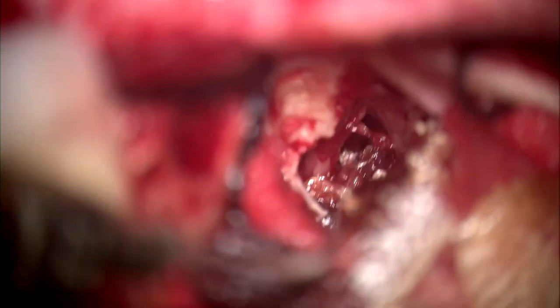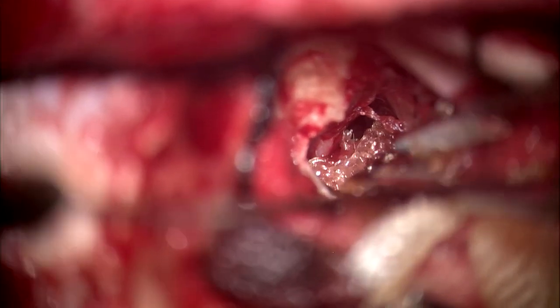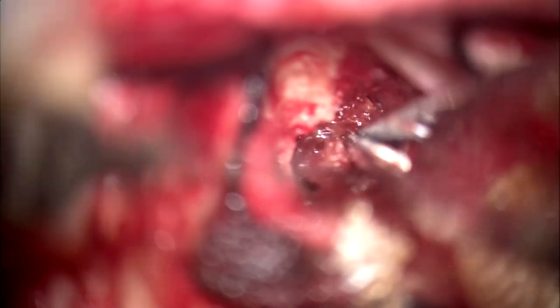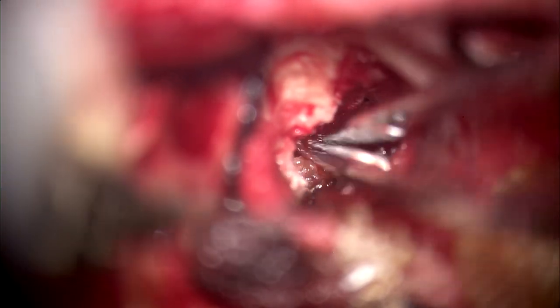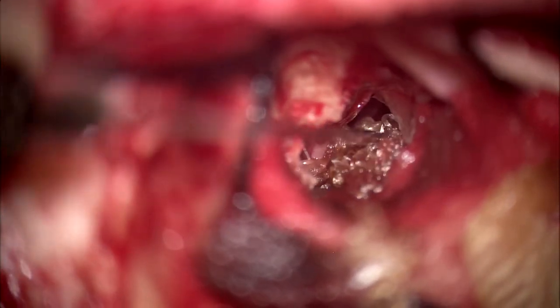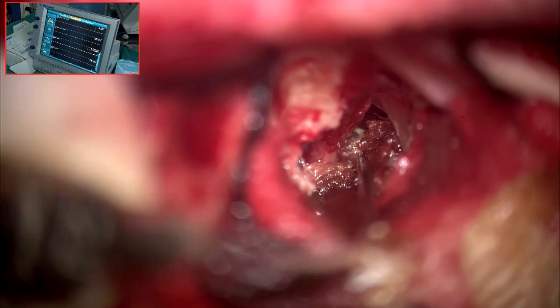See that the facial nerve now. Yes, sir. See in the middle of the field. Can you see or not this facial nerve now? Yes, we can see, sir. That's the facial nerve. Now, give me the monitor. Another monitor. See the entire course right from the internal auditory meatus to the brain stem, the course of facial nerve. Tumor being completely removed. Yes, sir.